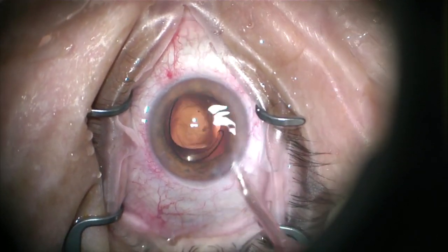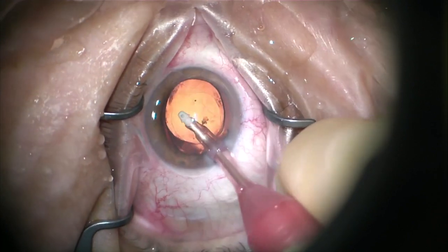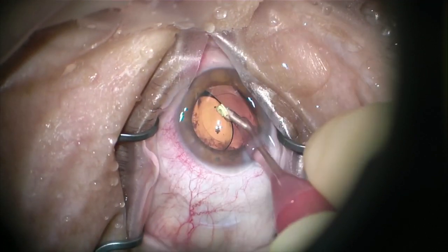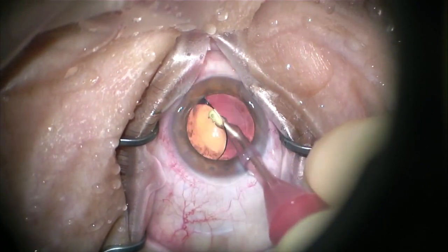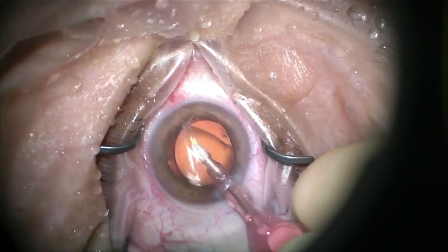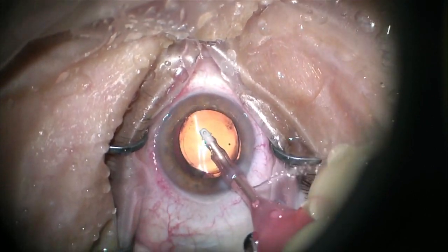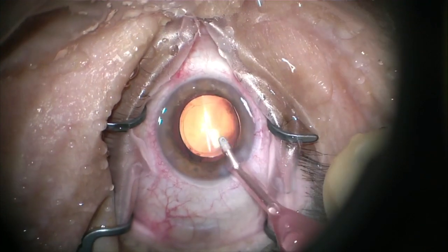Once both haptics are opening up and the capsule is in the bag, you can go ahead and start doing your I/A to get the viscoelastic out. I usually go on top of the lens first and nudge the lens over out of the way, lift up a little, make sure your port is facing up towards the cornea, and then you can remove the viscoelastic behind the lens. Finish cleaning up in the anterior chamber — I try to get it all if I can. If you don't, it's not going to be the end of the world; you might have a little pressure spike, but no big deal.